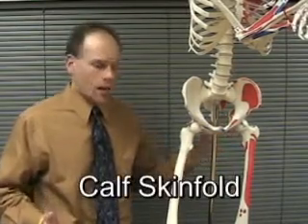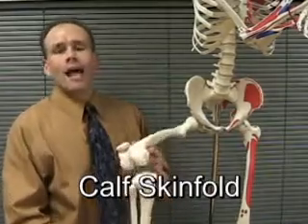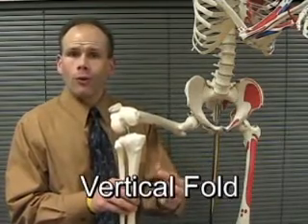One other lower body measurement that's not as common is the calf skin fold. The calf skin fold is taken at the largest circumference of the calf, which is usually in the upper third of the calf, and we take a vertical fold on the most medial side at that largest circumference. Most people don't store a lot of fat in their calves, so this measurement doesn't tend to be that large. It also tends to be one where you may have a little bit of trouble pulling the subcutaneous fat away from the muscle. Be sure to warn your subject that it might hurt just a little bit.